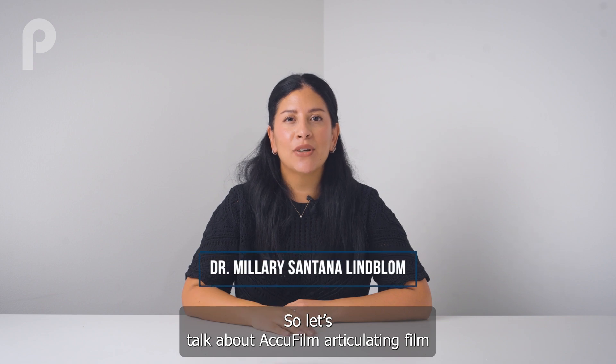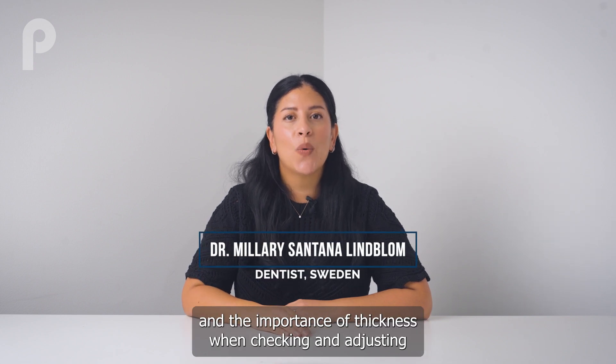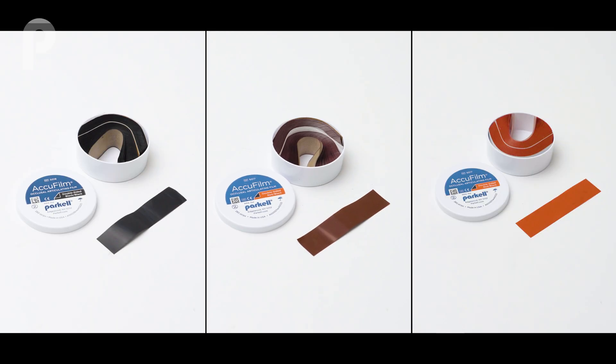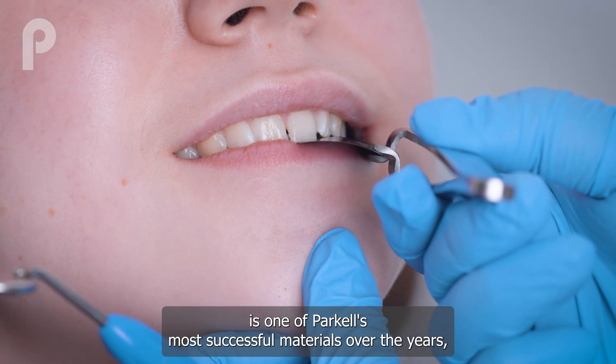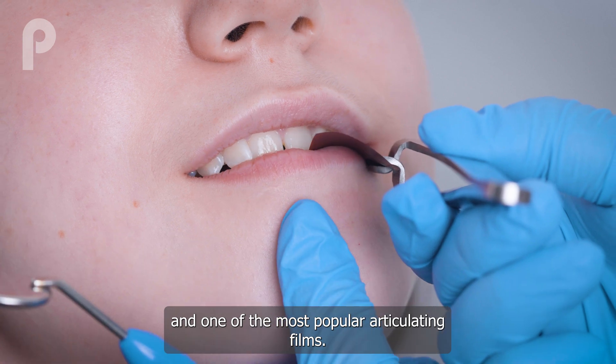Let's talk about AccuFilm Articulating Film and the importance of thickness when checking and adjusting occlusion. AccuFilm is one of Parkel's most successful materials over the years and one of the most popular articulating films.